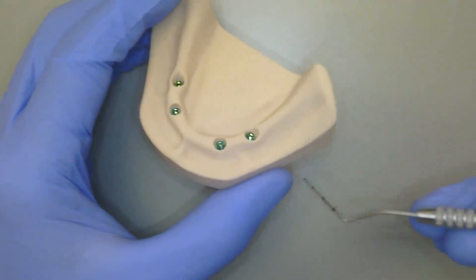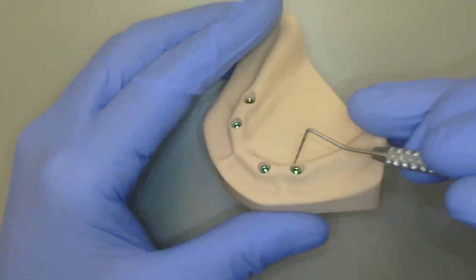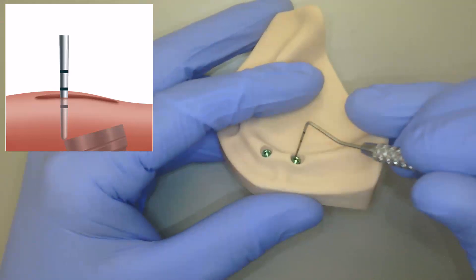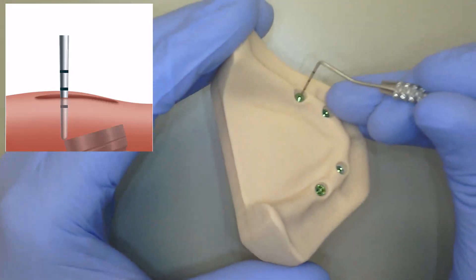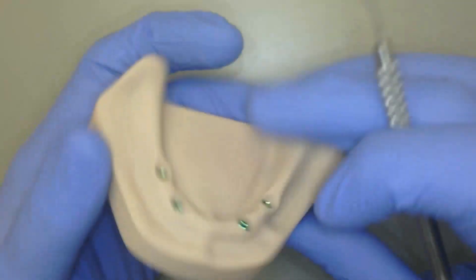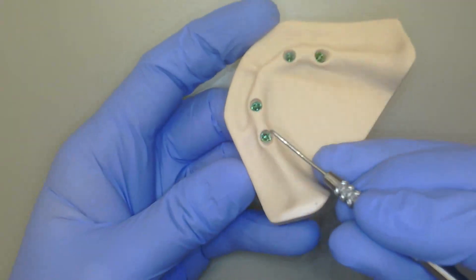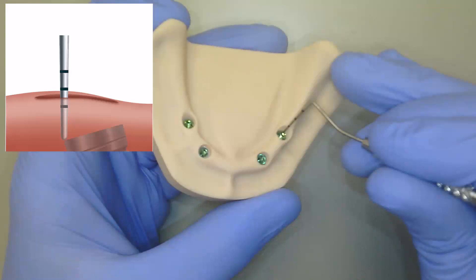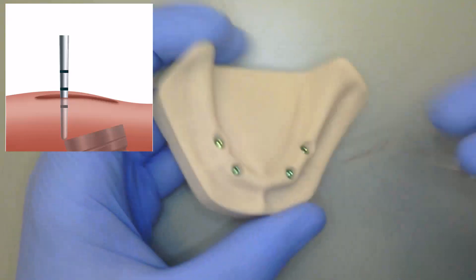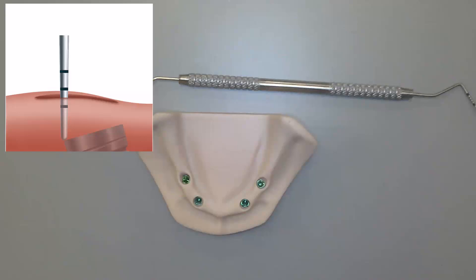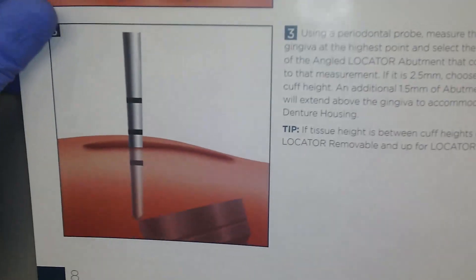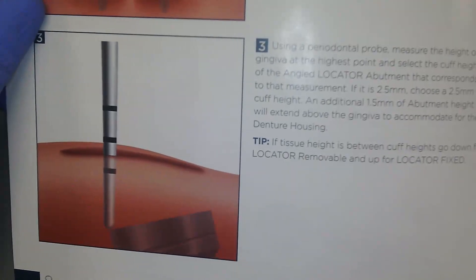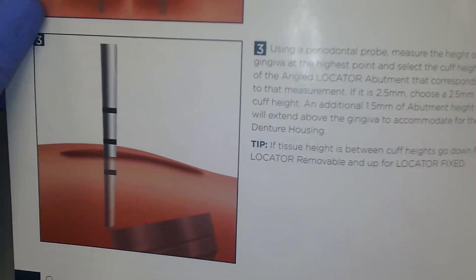As I take a look at my distally placed implants, I'm going to measure starting on the lingual — I've got two millimeters here. On the buccal or facial, it's another two millimeters. As I come to the mesial, I can see two and a half millimeters. And then on the distal, I'm measuring three and a half millimeters from the edge of that platform. Looking at my technique manual, Zest recommends choosing the highest of those measurements. It's typically going to be in the most distal position, or wherever your most angulation is.